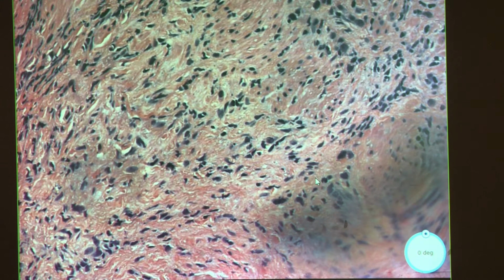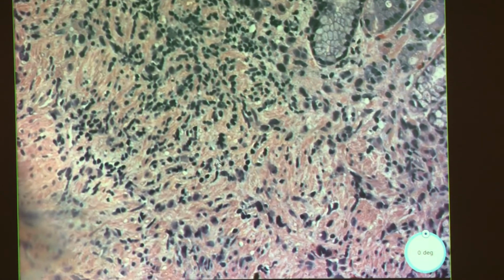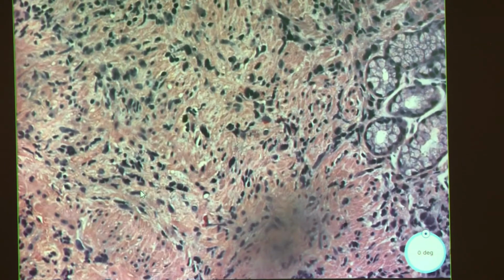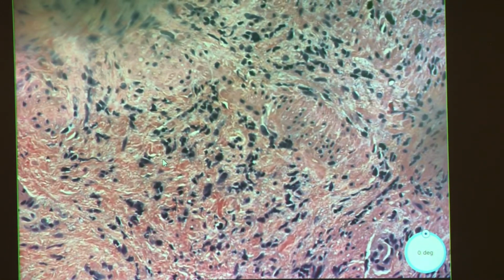Sorry, not on the same train of thought here. Okay. So your lymphomas are discohesive, melanomas, things like lobular carcinomas, but poorly differentiated carcinomas are in that realm too. Okay. Yeah. So the stain you'd want to do is basically to prove is this carcinoma. Okay. Simply because if you're going into those other realms, then you'd want to do a bunch of other stains, right?